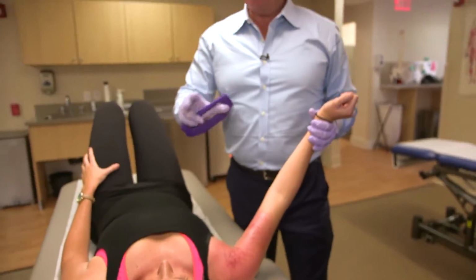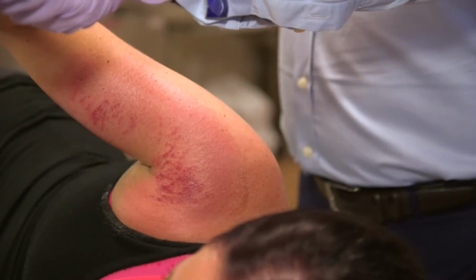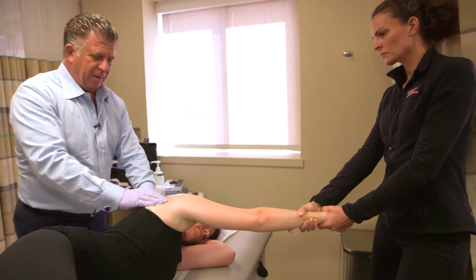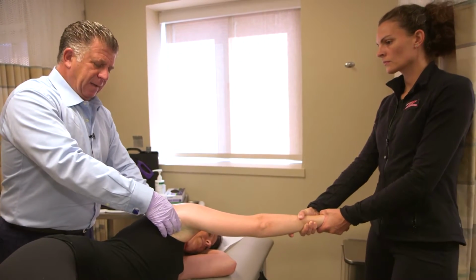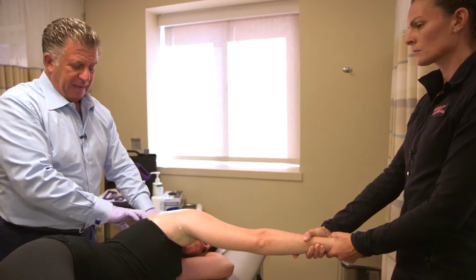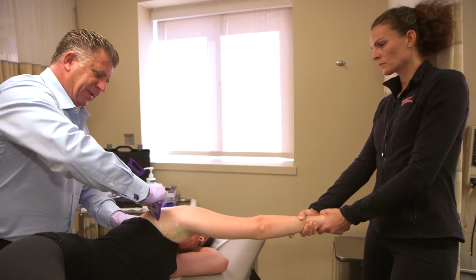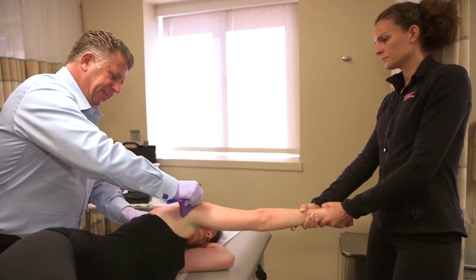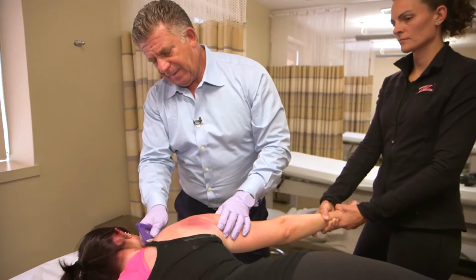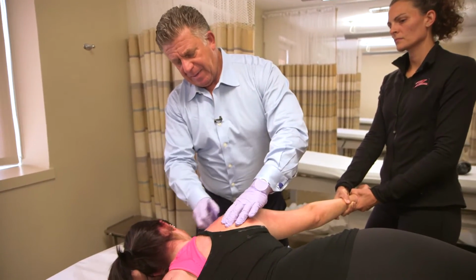We now will ask Francie to turn onto her left shoulder. Jen, you're going to come around and grab her right wrist. Yep. All right. So now we're going to address the muscles in the back of Francie's right shoulder, which are the rotator cuff muscles, the supraspinatus, infraspinatus, and the teres. For that, this is the best position for me to get to these muscle groups. Here's the supraspinatus, which is usually the culprit with most of the rotator cuff injuries. We're going over the spine of the scapula.